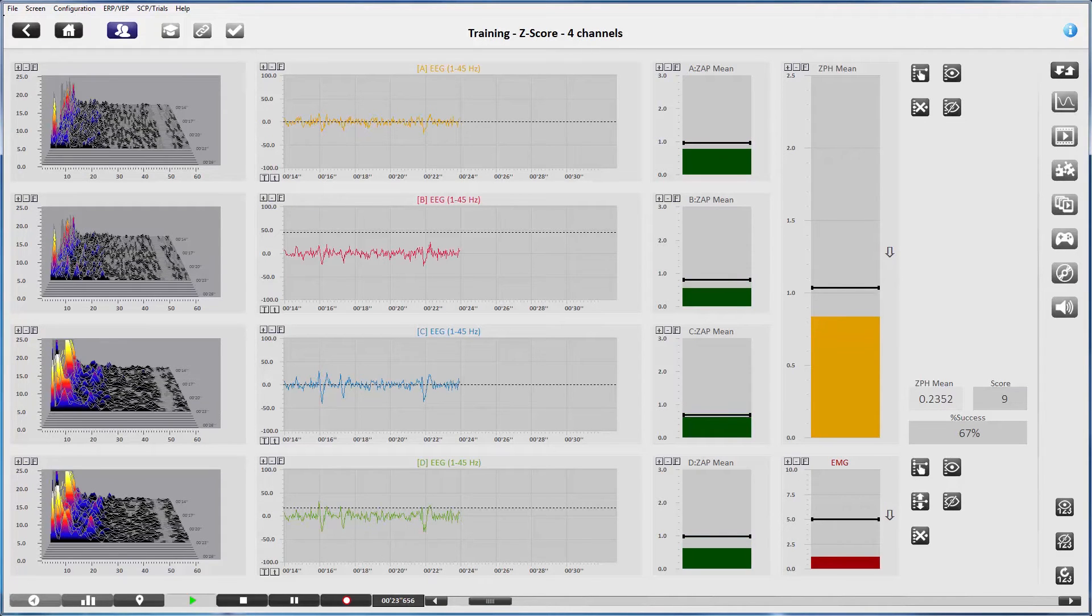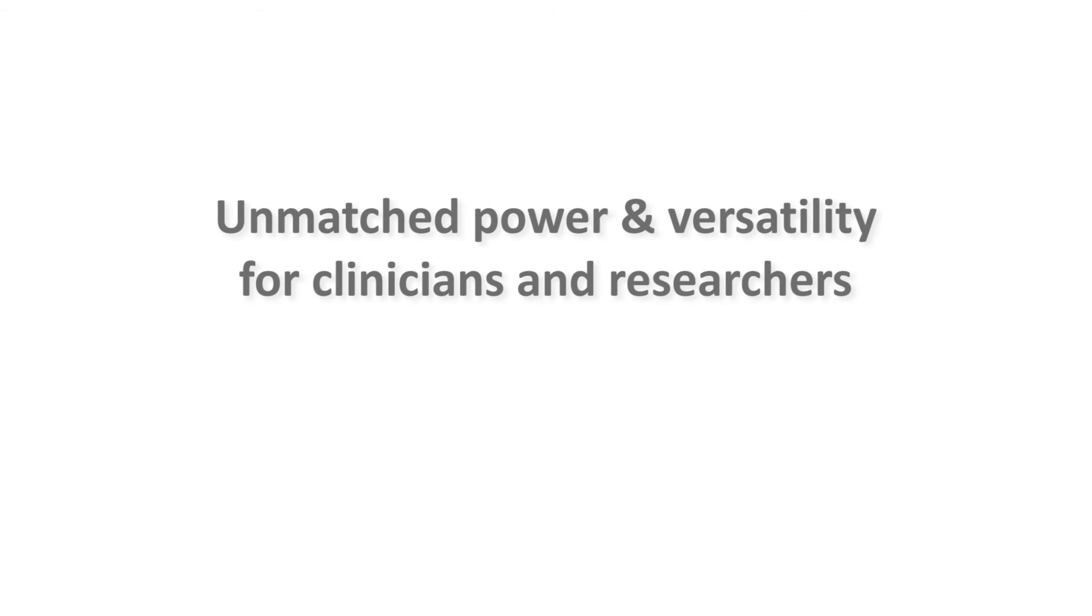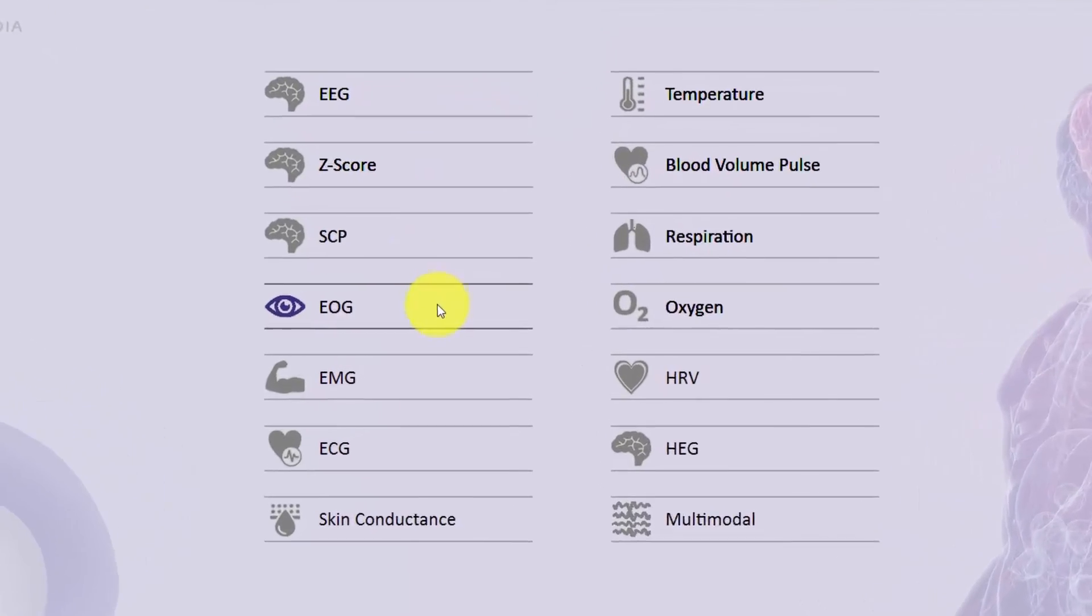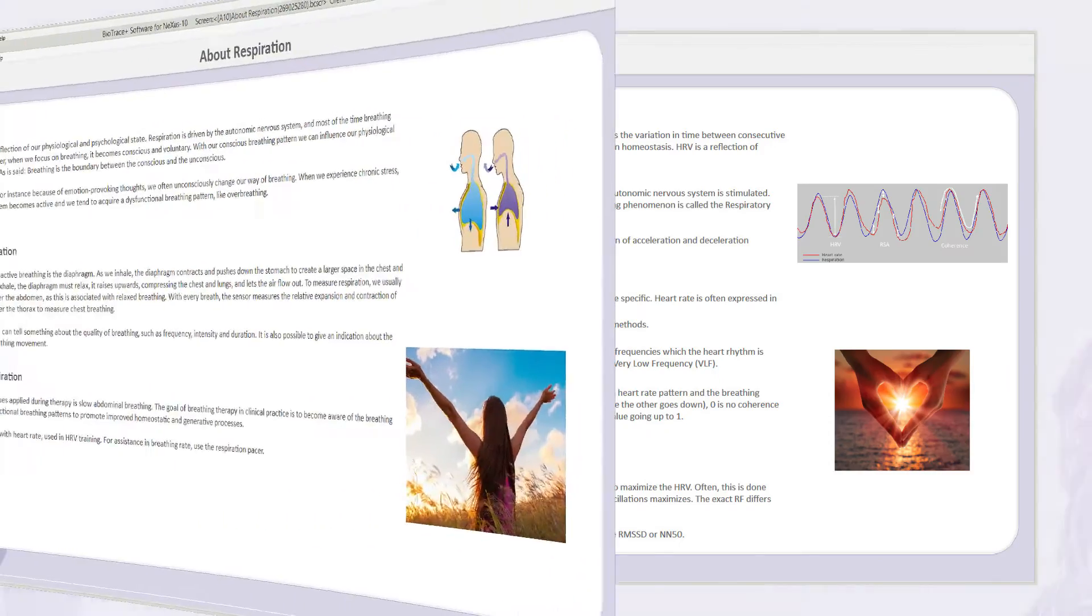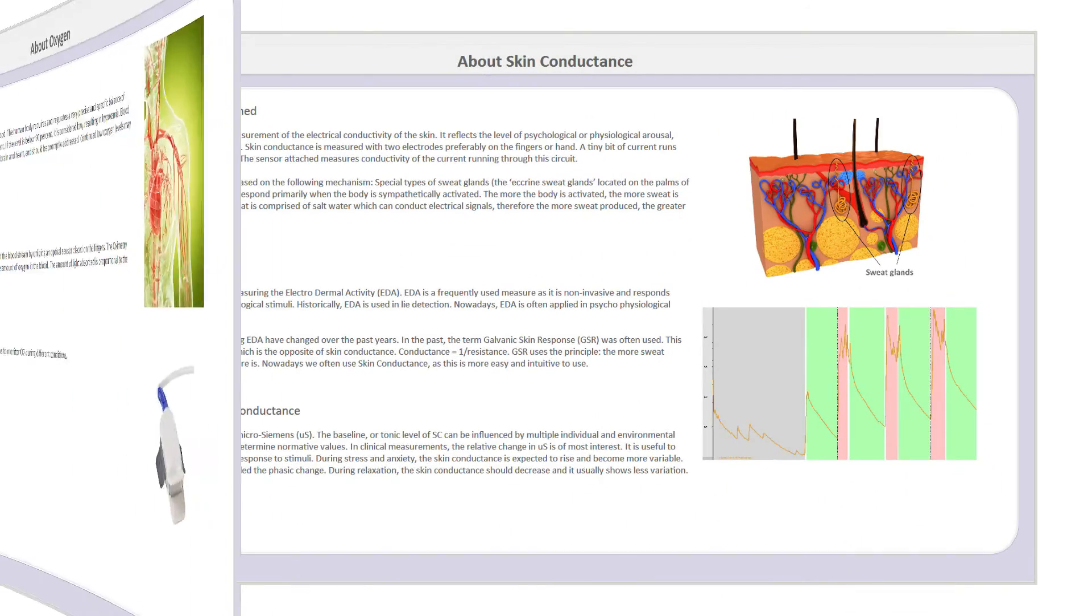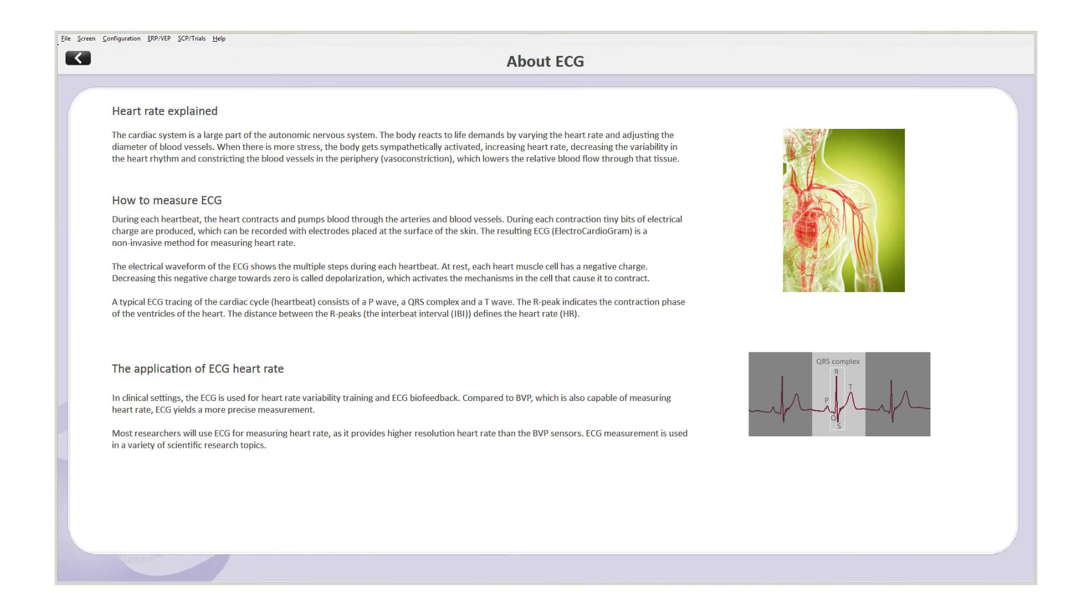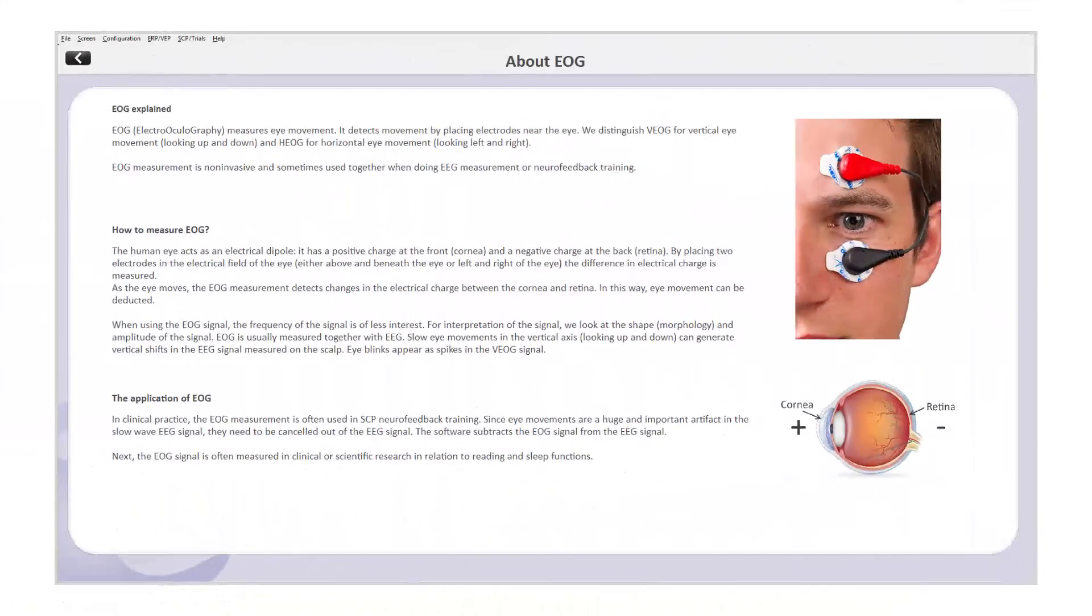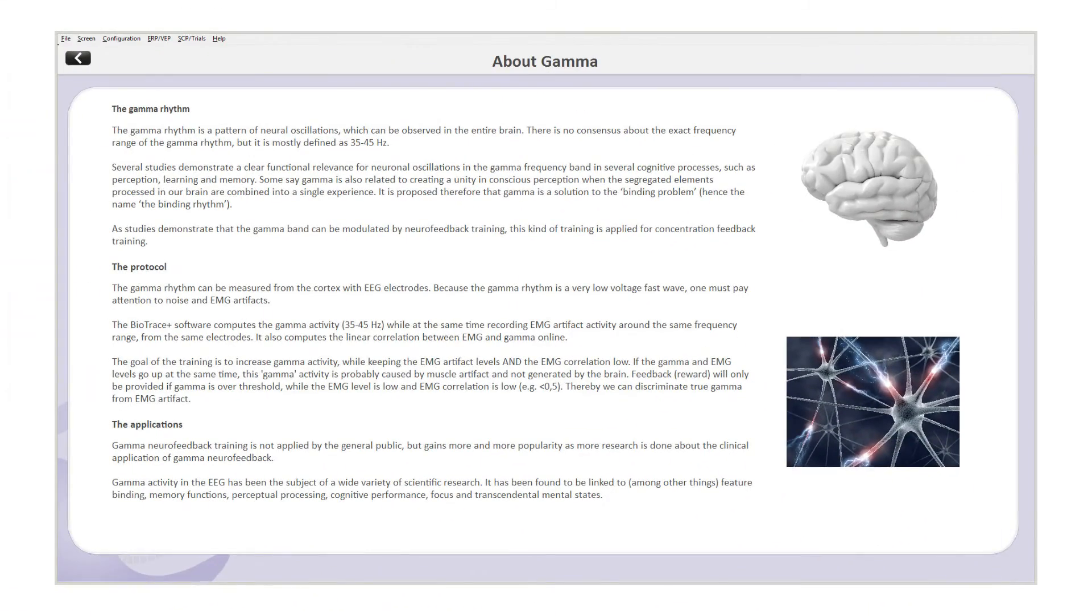BioTrace Plus for Nexus is versatile multimodal software, as you can see in the signal library. More applications will be added in the future. It is truly a very complete platform for physiological data acquisition, biofeedback, and neurofeedback.